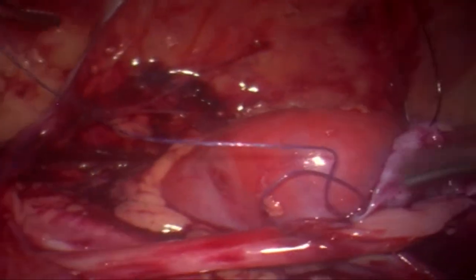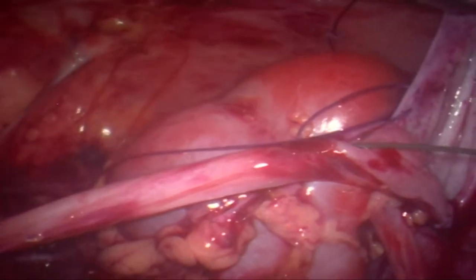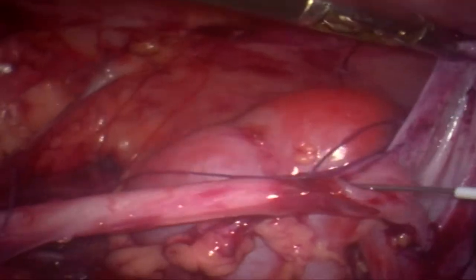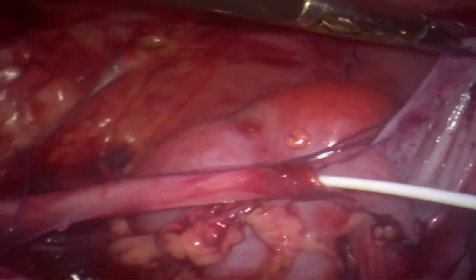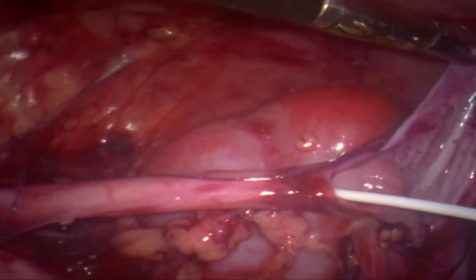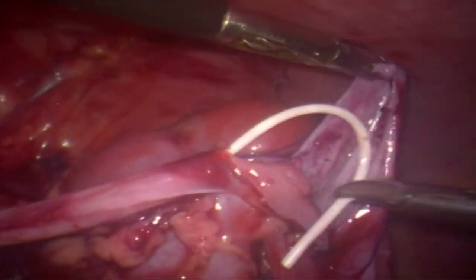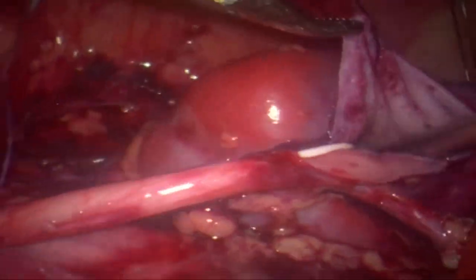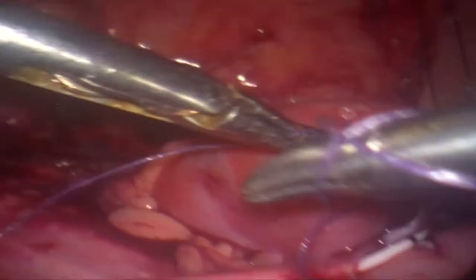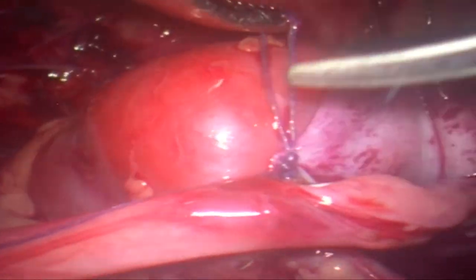That has come to the heel. We are now ensuring that the lumen is patent. The JJ stent is being inserted via a 3mm suction catheter from the top port over a guidewire. Once this is positioned comfortably, we will tie the knot at the heel, which normally we do first. But in this case, because of the malrotation as well as the posteriorly rotated pelvis, we have to do it from top to bottom.